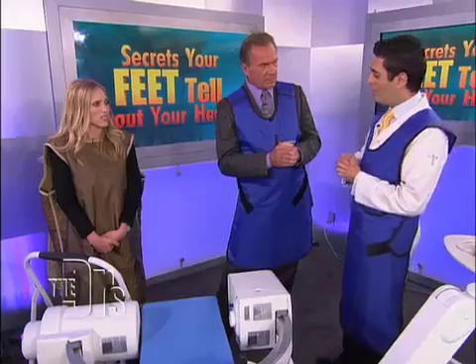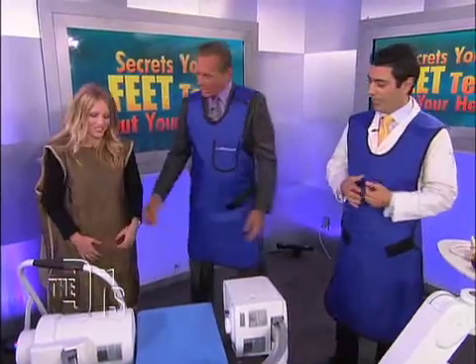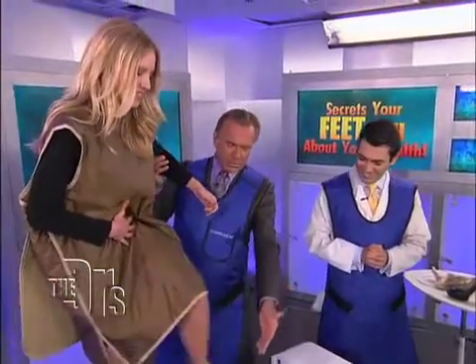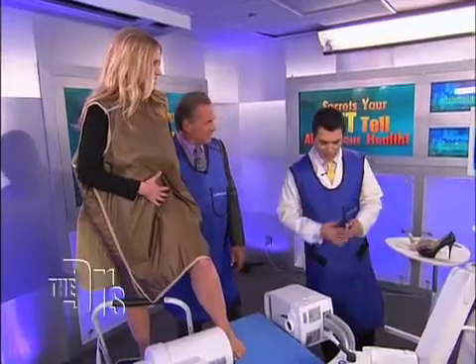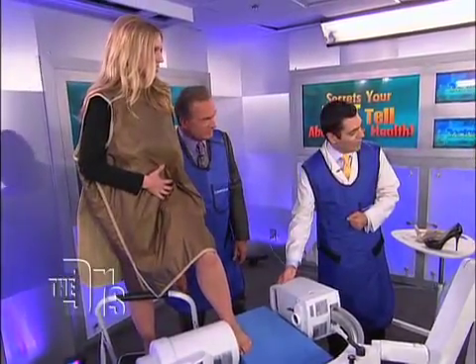We can show you a demonstration of what happens to the foot structure with this cool device. You want to step up? Let me help you here, Wendy — put that foot right here. I won't let you fall. This is a FLURISCAN. It's a real-time radiography system by Holistic, and what we can do is actually take an image of the foot.